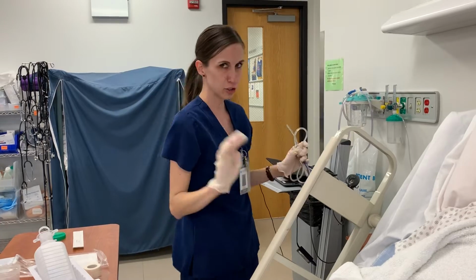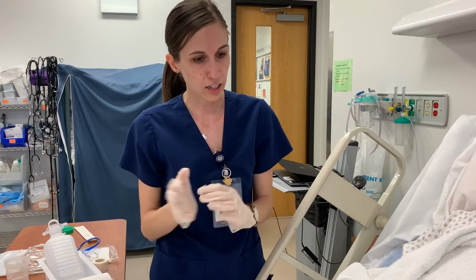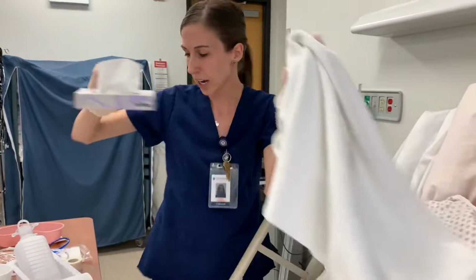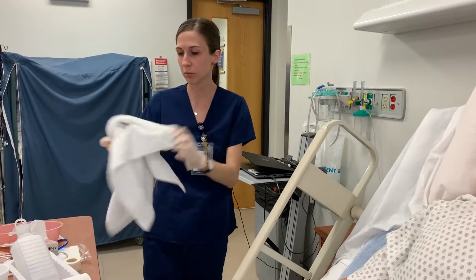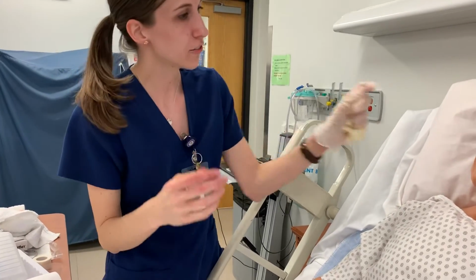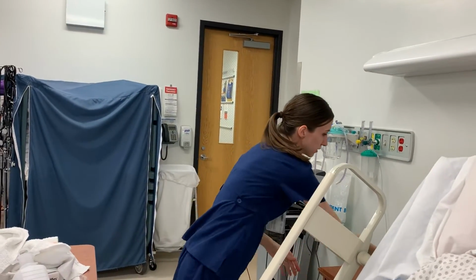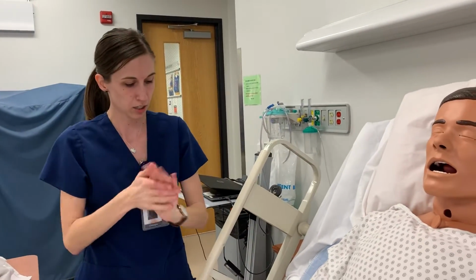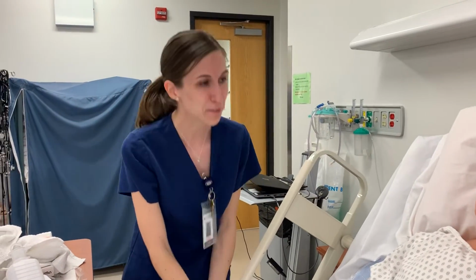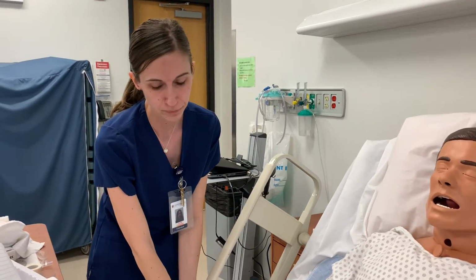You guys are saving your NG tube, so you can just place it on the table, but otherwise I would throw that into the garbage. Again, I can remove any items from my patient's bed, move their towel, place this into the dirty linen receptacle, but again, just saving. I would go ahead and again offer any comfort. I can dry up the nose if needed, assess that my patient is comfortable while I am removing my gloves and doing my hand hygiene. Then I am going to start again lowering my patient. Again, it's a little bit of time to get all the way down, so again, make sure your patient is comfortable, how they've tolerated this procedure.